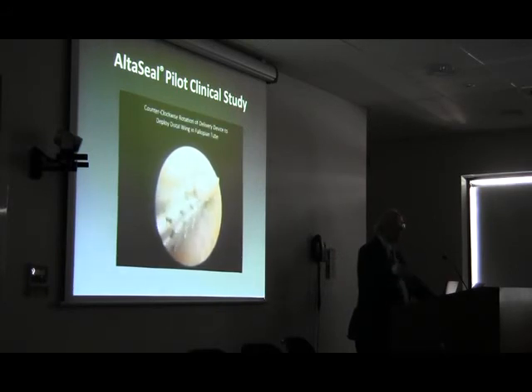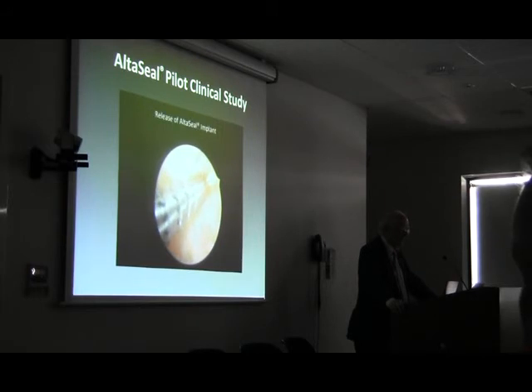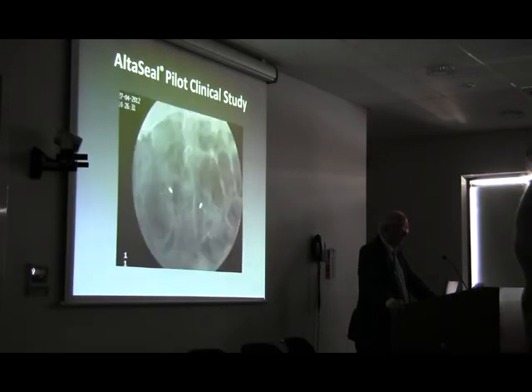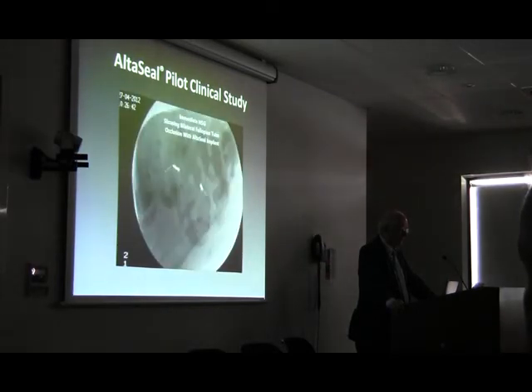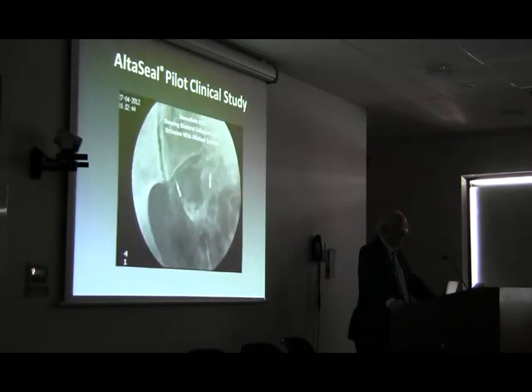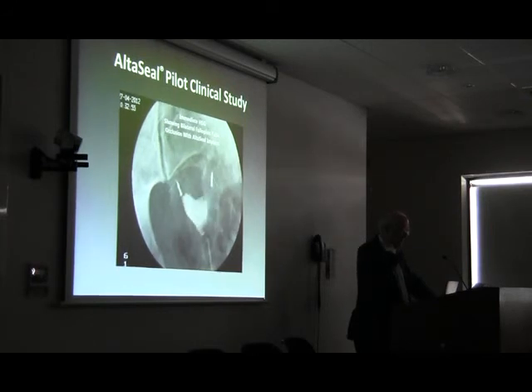But this has gone through several years of development, as you can imagine, on hysterectomy specimens, and it's now reached a stage where there are people actually walking around with it in. So for the studies now, you can see the little devices there, and we put in dye there just to confirm that there is occlusion at the moment.